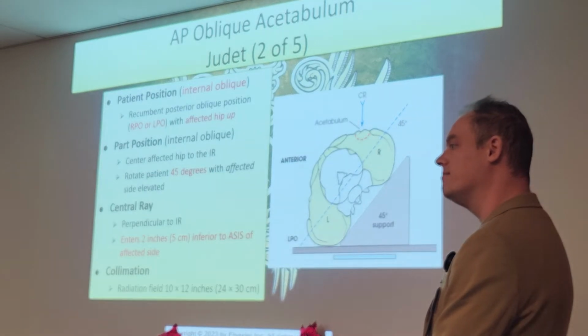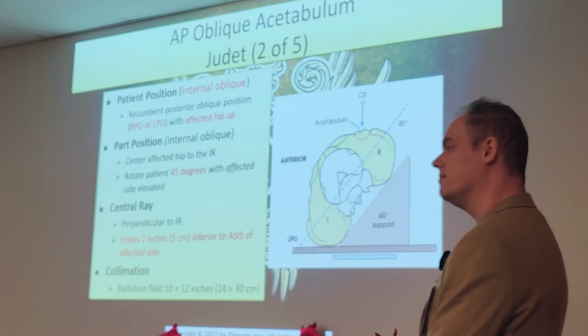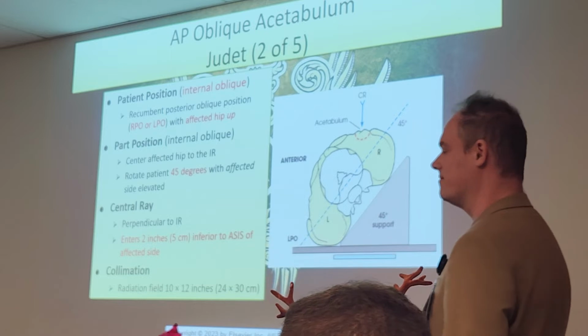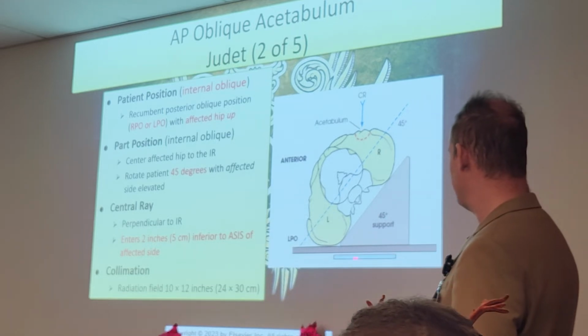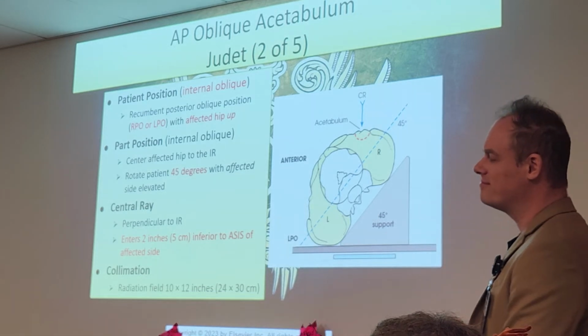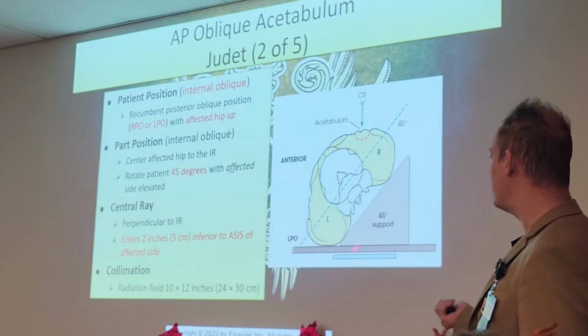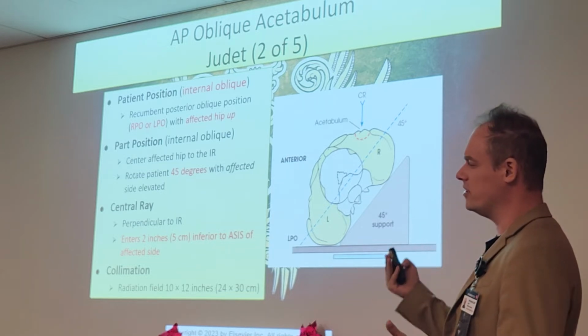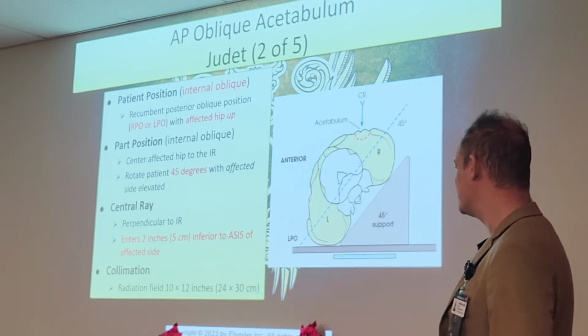What is that blue thing supposed to be? That's the cassette. Do you feel like a wedge? Yeah, if you have one of these nice sponges, it puts them in a natural 45, a little easier than trying to do it yourself, but we don't always have these, unfortunately.